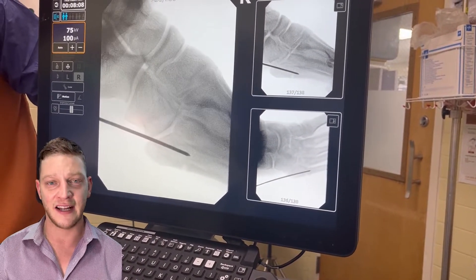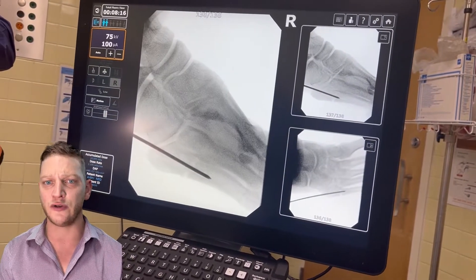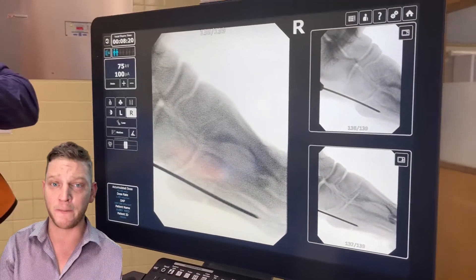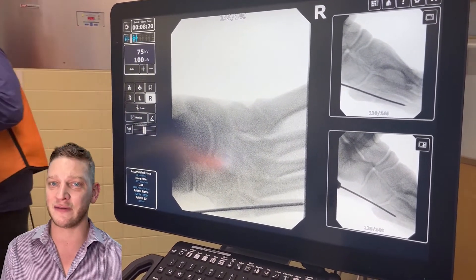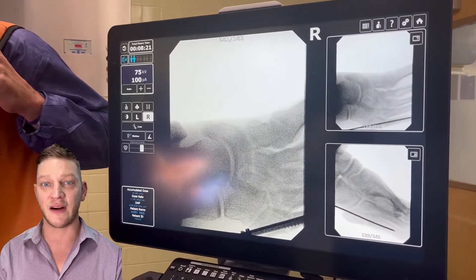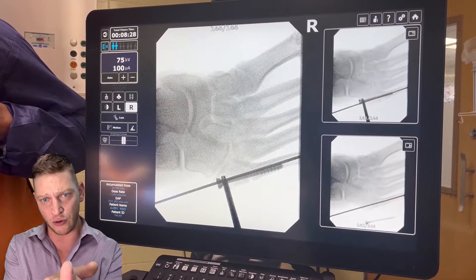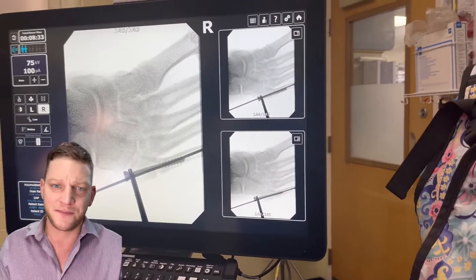Now the easy part comes — we throw the screw. The hard part was the K-wire. This is not a cannulated screw. With Jones fractures you need a solid screw, so the K-wire comes out. We're going to put some platelet-derived growth factor in to encourage healing. The screw is partially threaded, meaning the back half has no threads. That's because we want the anterior fragment — closer to the toes — grabbed by the threads and pulled in, creating compression between the two fragments. A fully threaded screw would require over-drilling the proximal fragment.